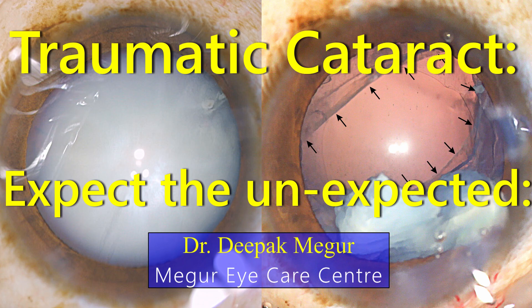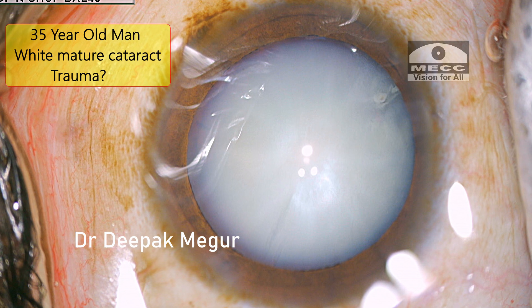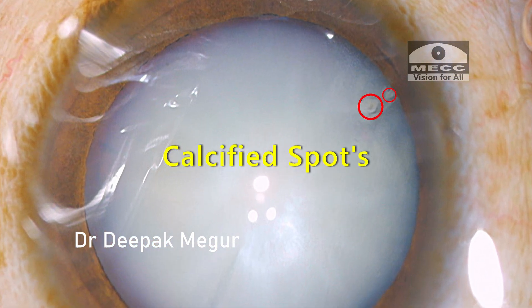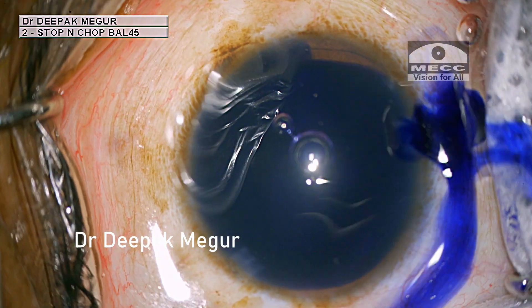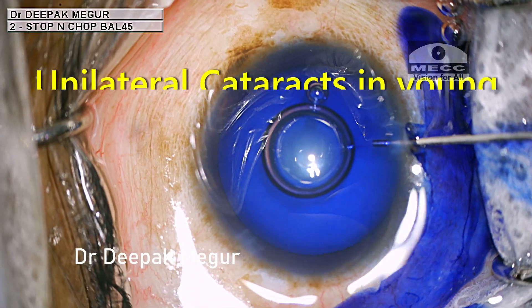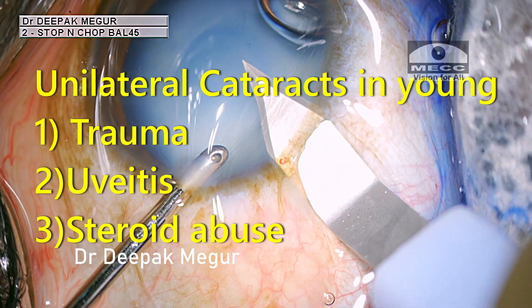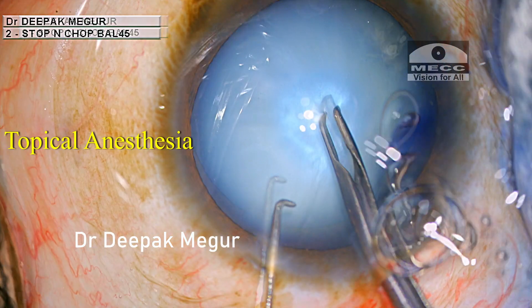A 35-year-old man with a unilateral white mature cataract wants surgery for that eye. He gives history of some vague trauma around the eye about two years back, but he's not sure whether he could correlate the trauma with his drop in vision. We can see two specks of calcified spots on the anterior capsule. In young patients with unilateral cataract, trauma, uveitis, and topical steroid abuse always need to be considered as the most common risk factors.